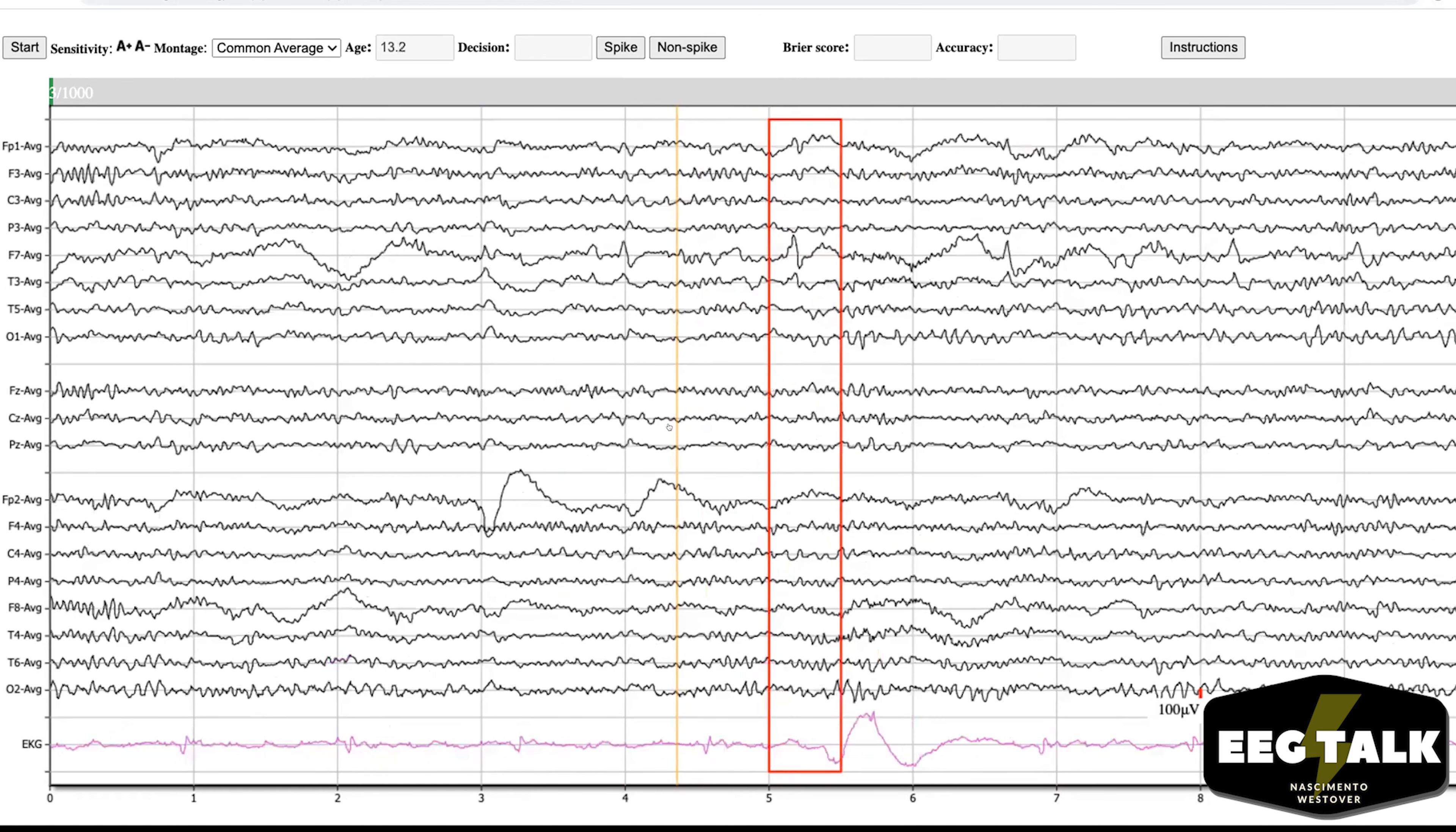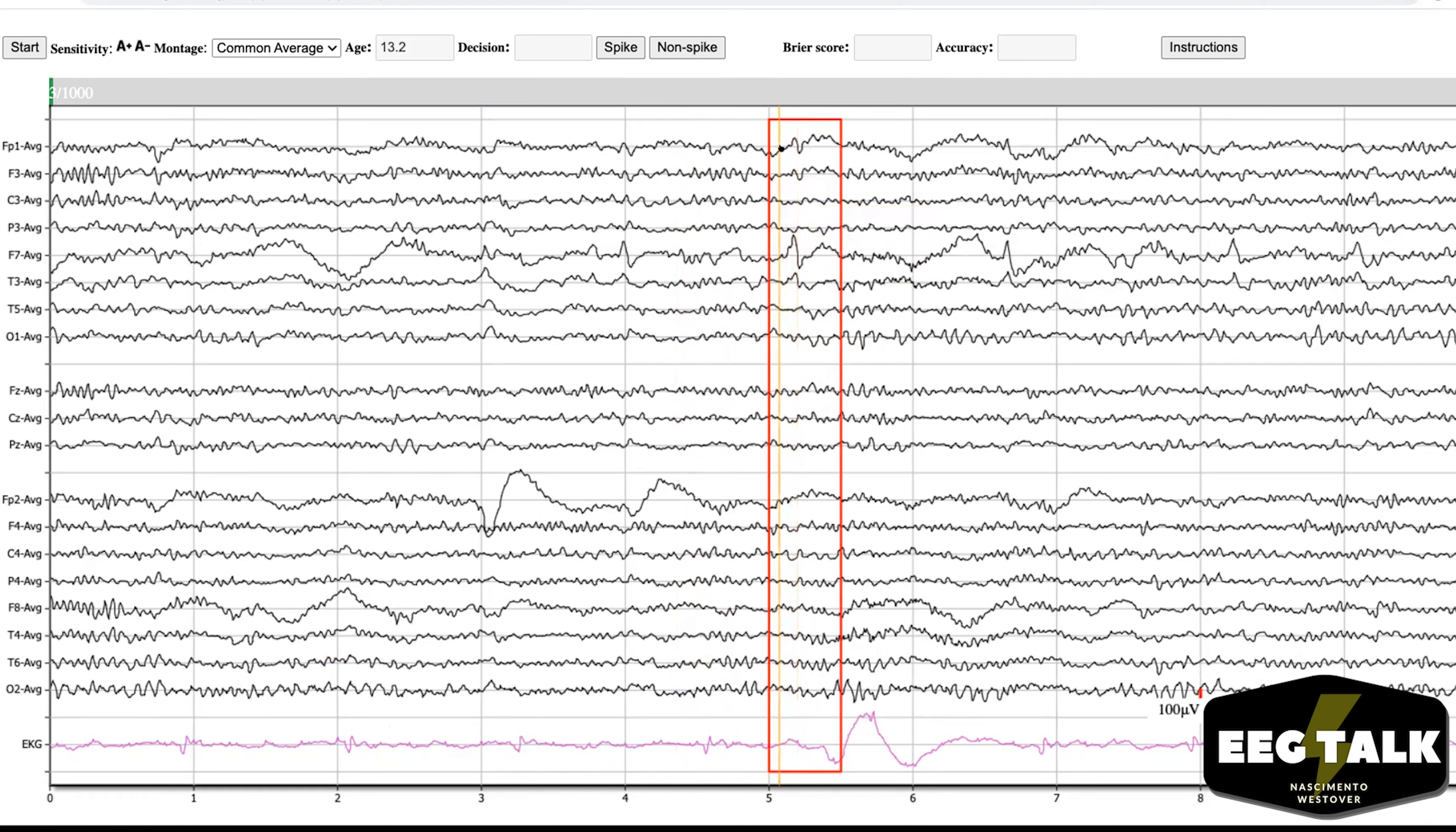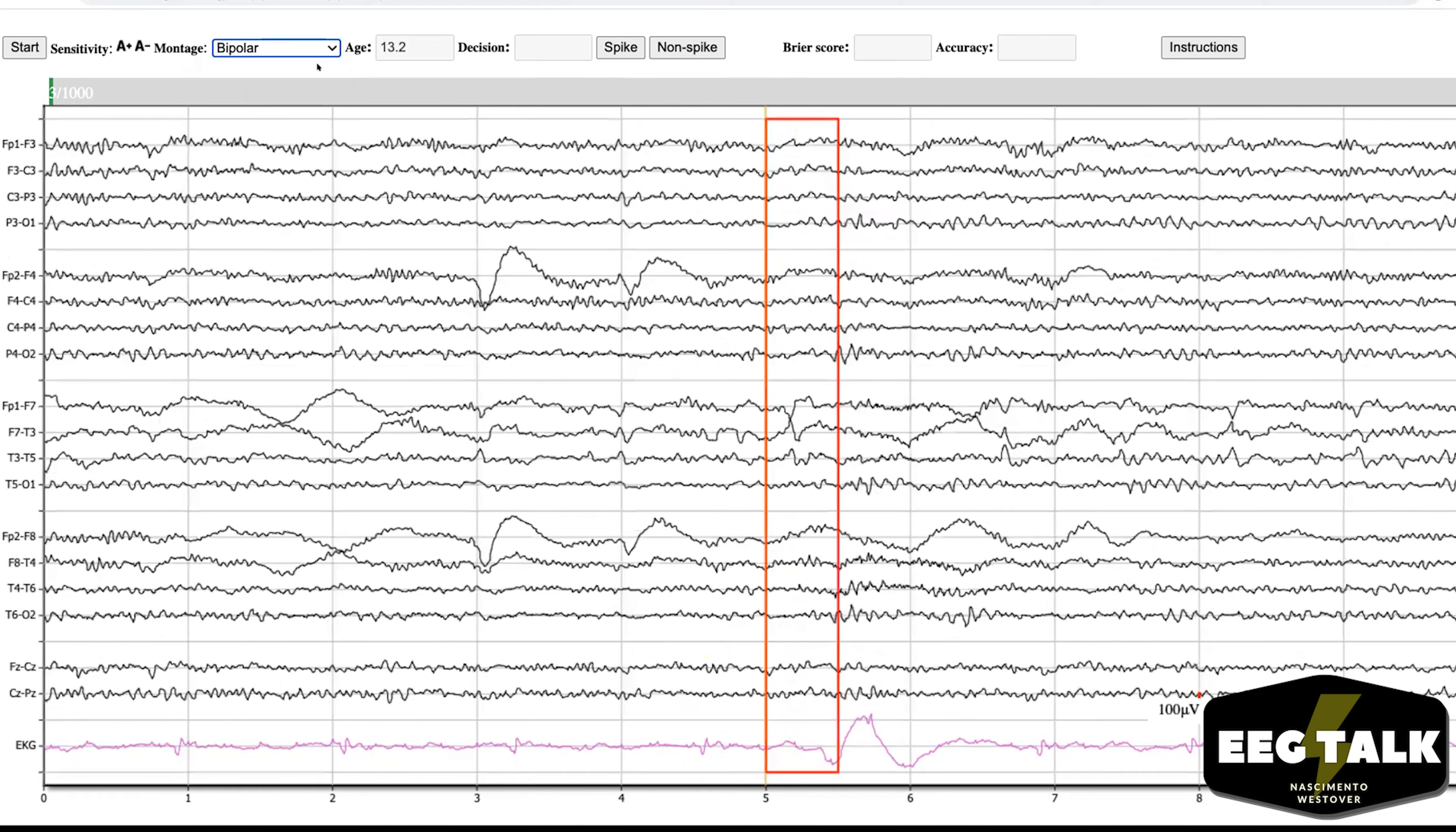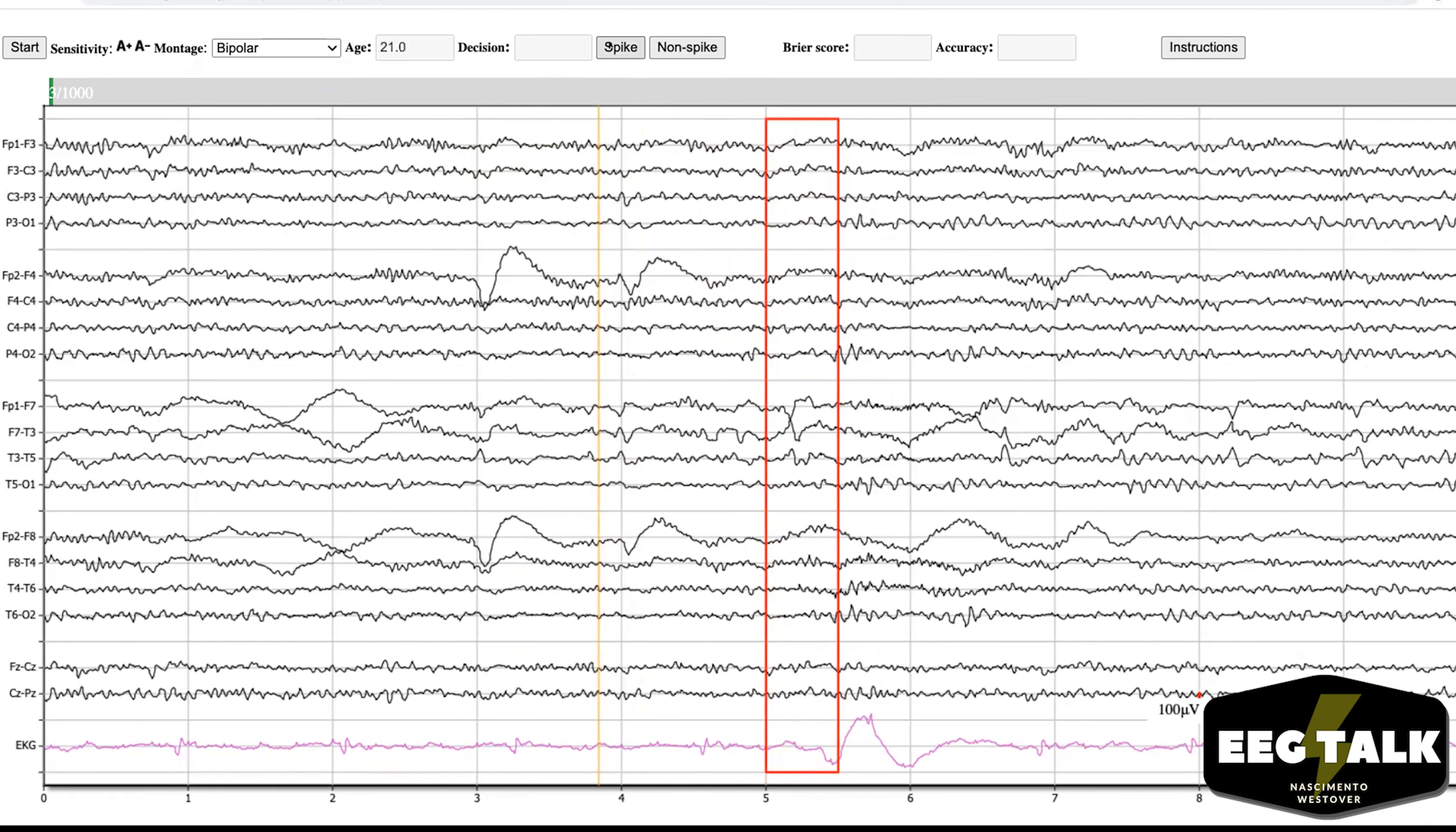Okay, so this one seems pretty localized. It doesn't have—it has a little bit of a field, I guess, to T3 and FP1. And it has a slow wave. I'm gonna say yes. Switch to bipolar? Yeah, I think I'm convinced too. JJ, what do you think? Awesome! Yay! Oh, that feels so great.